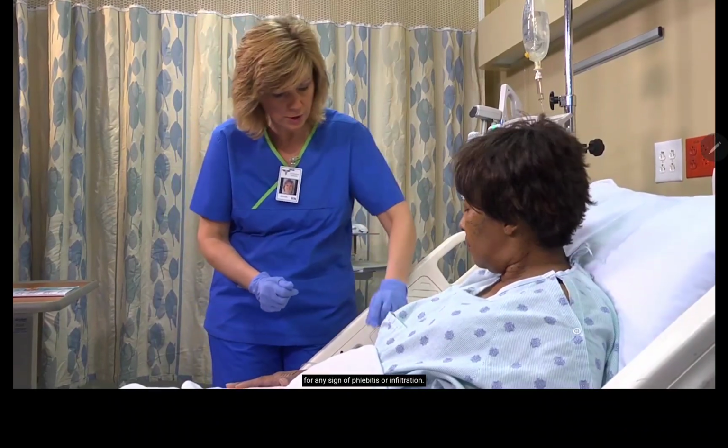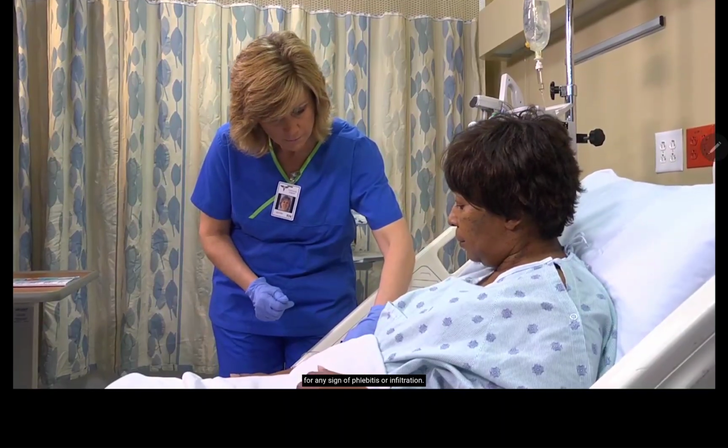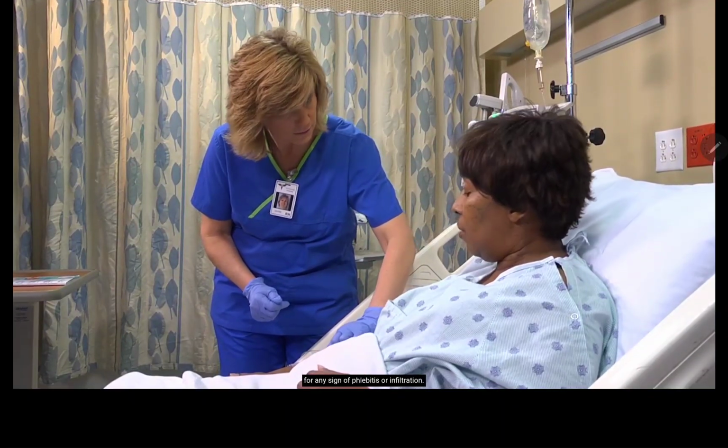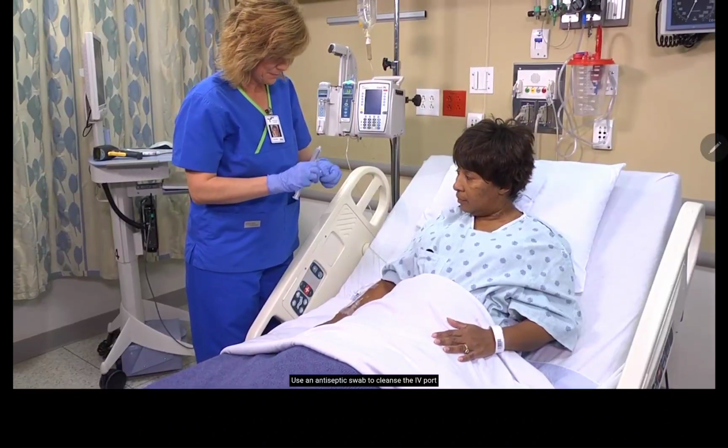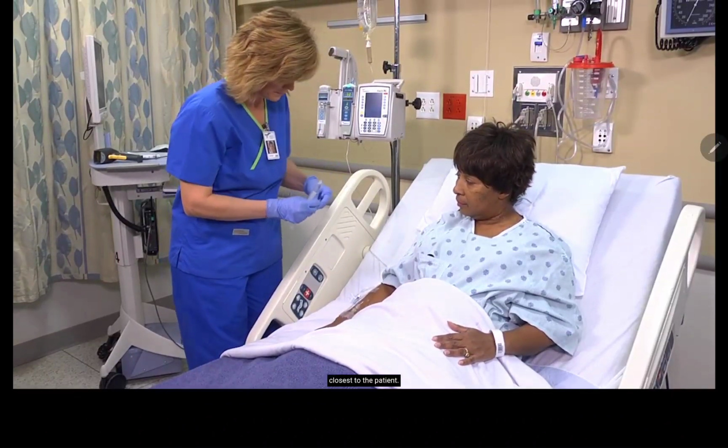All right, I'm just going to check your IV site now. Okay. Is it tender at all? No. Okay, good. Use an antiseptic swab to cleanse the IV port closest to the patient.